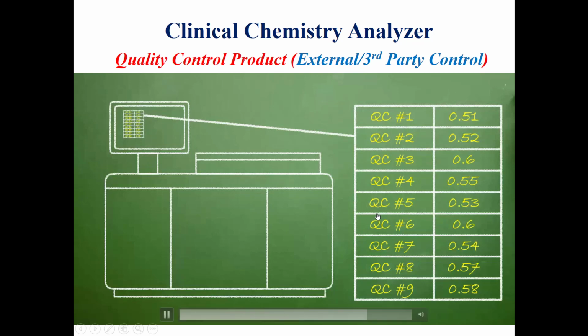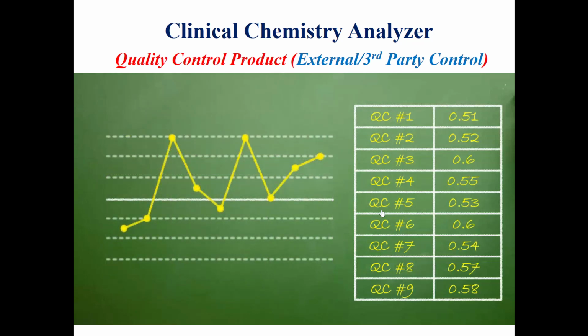SDs, or standard deviations, sound complicated, but if you review our Blackboard videos on statistics, you'll find that they're really quite simple. Regular testing of QC material creates a QC database that the lab uses to verify the test system. This verification occurs by comparing daily QC results to lab-defined ranges of QC values. There are a number of ways to determine if a control is acceptable. The most common approach is Westgard Rules. If you're interested, check out our Blackboard.